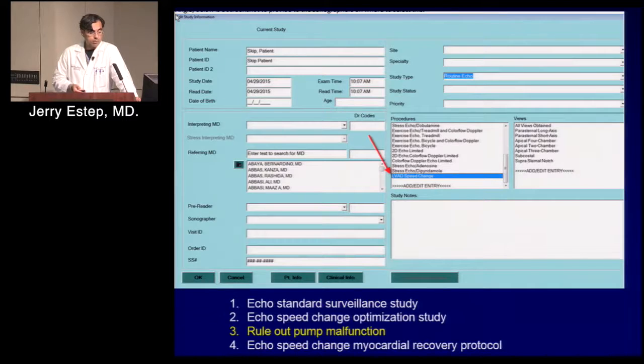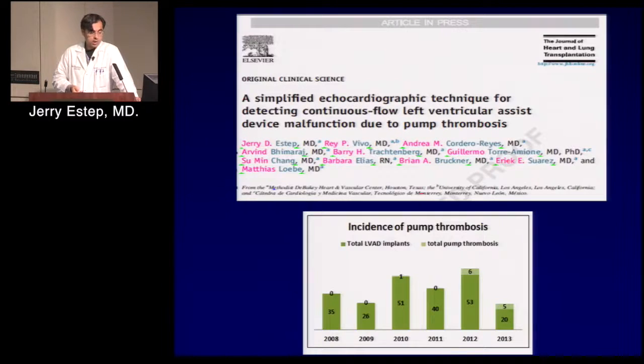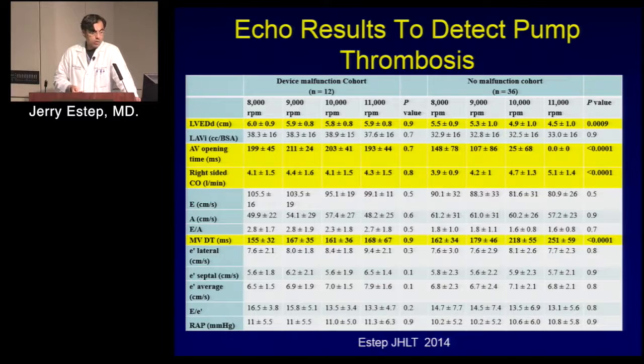Now, let's jump into our pump malfunction protocol. And for time's sake, I'm going to skip some of the seminal work done with the Columbia group. But what they demonstrated is what I've mentioned, and we've been using it for years as well. When you increase the pump speed, you should see changes in size of LV and aortic valve function, in addition to some console things. So when we looked at our cohort and looked at the full breadth of echo parameters, the changes you should see, and they're listed there in yellow, are LV size, aortic valve opening, augmented right-sided cardiac output. And your mitral valve deceleration times with greater unloading should also become more prolonged.